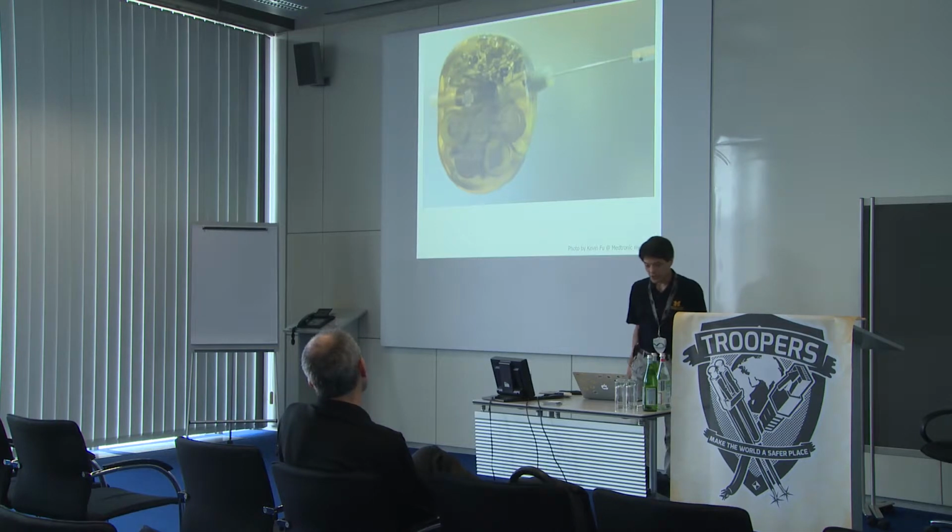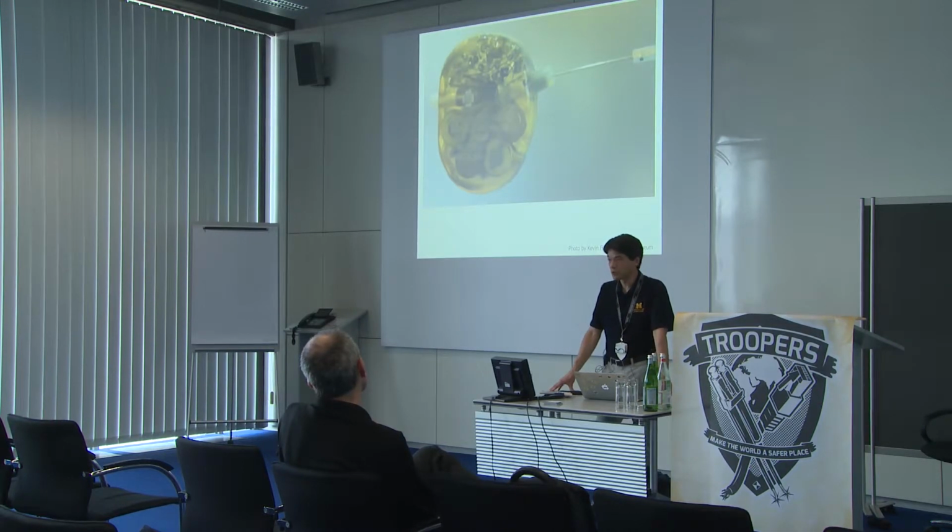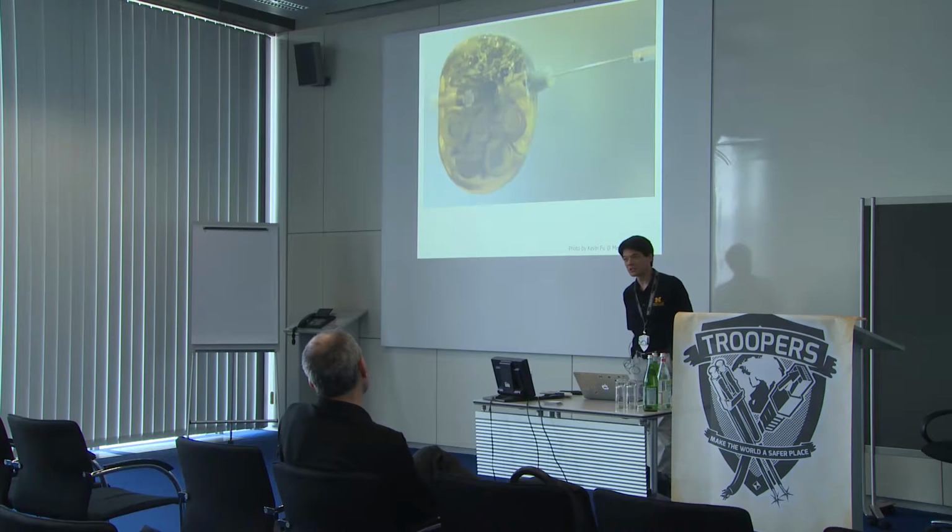So here's a picture of an early implantable cardiac device. And this is not wirelessly controllable. There is no kind of RF interface to change it. So how do you think you would change a device if you don't have wireless control? Crack them open? Crack what open?